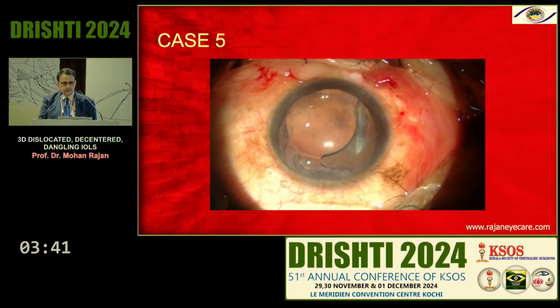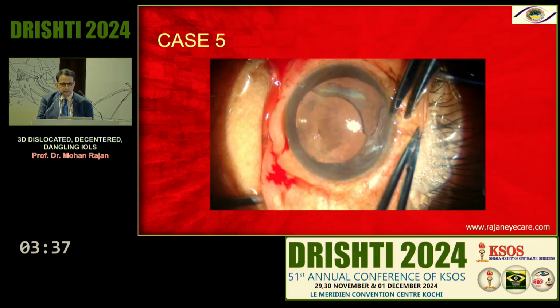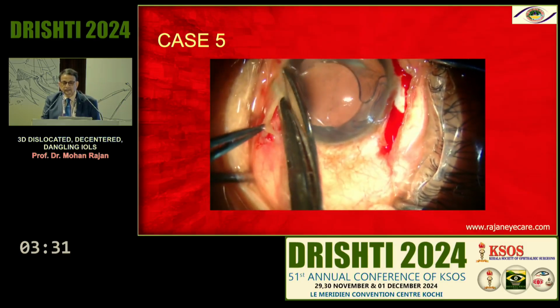Again, another patient, you can see here, this is a hydrophilic lens, something like a Rayner type. This hydrophilic lens, I tried to fix it. The problem with this hydrophilic lens, I didn't even realize that.